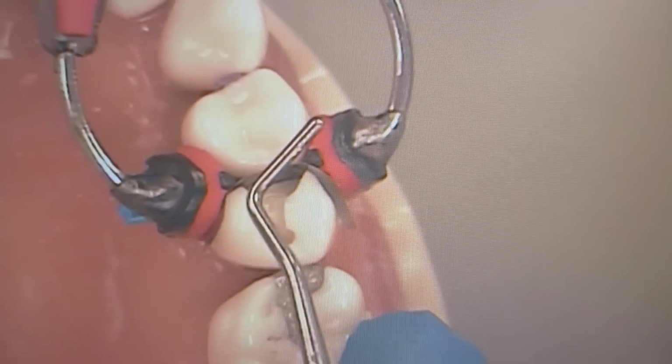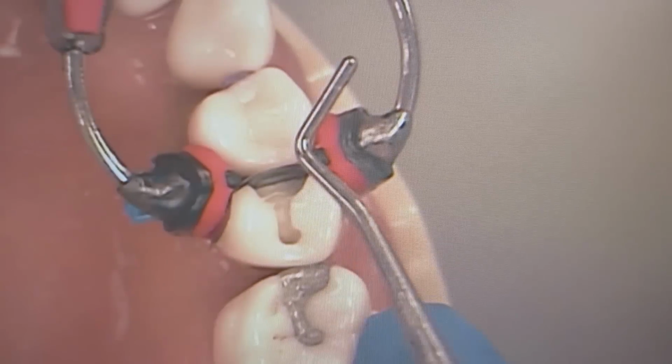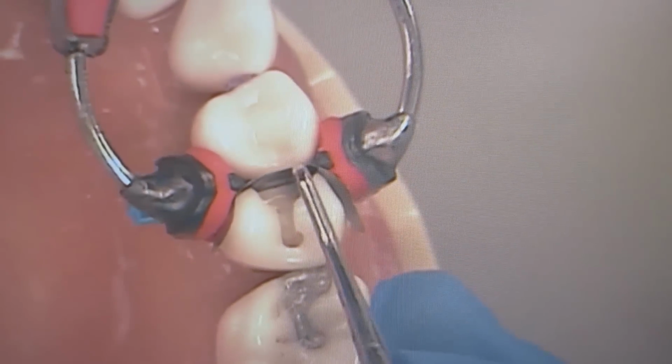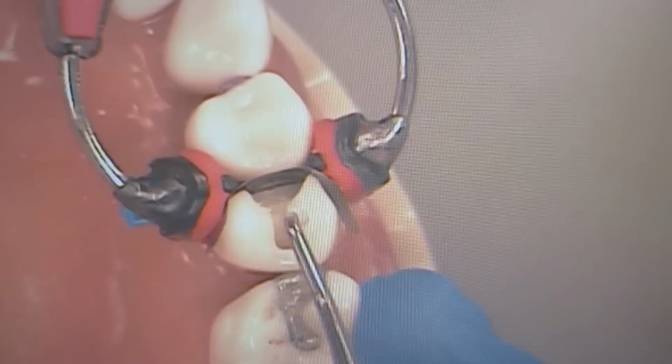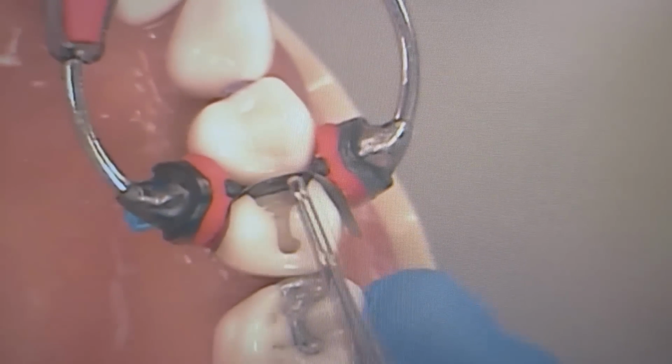Show us, you can do camera. Play by play. Dr. Chui is burnishing. You like burnishing for the recording lectures, getting the contours correct and making sure the contact is correct.